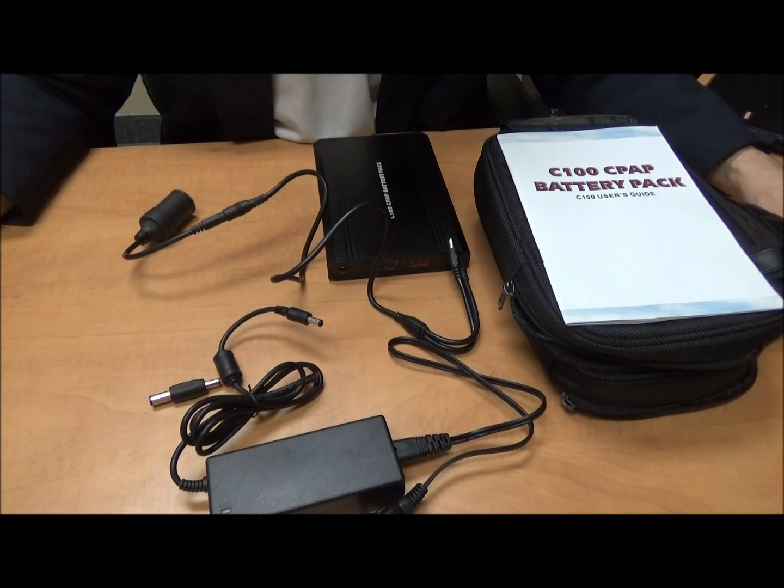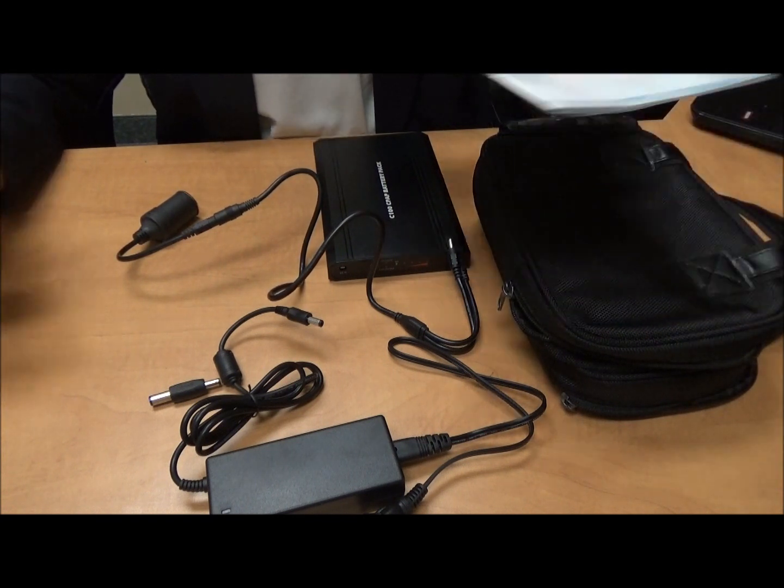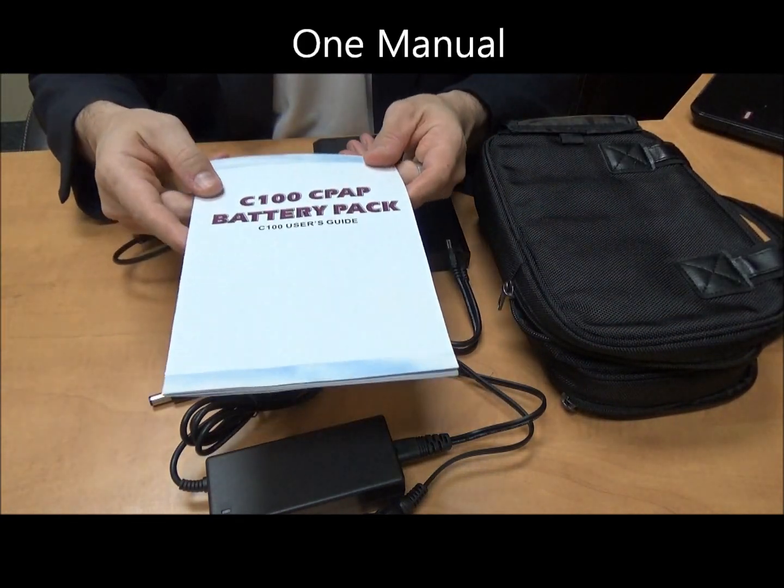We have in front of us all the components that should be coming inside your order when you receive it. If something is missing, please do let us know. Let's quickly go over what you should be getting in the pack.